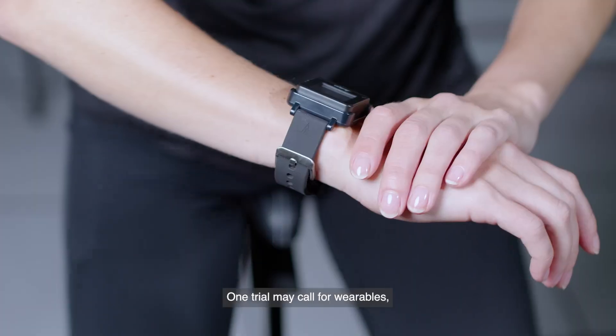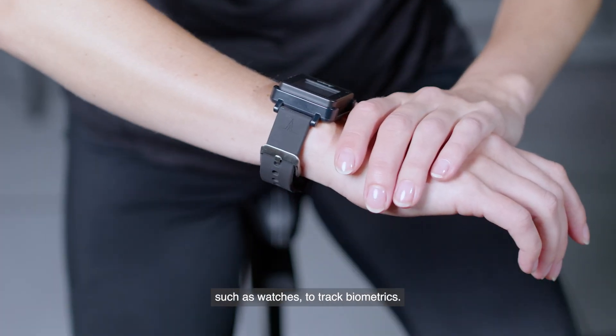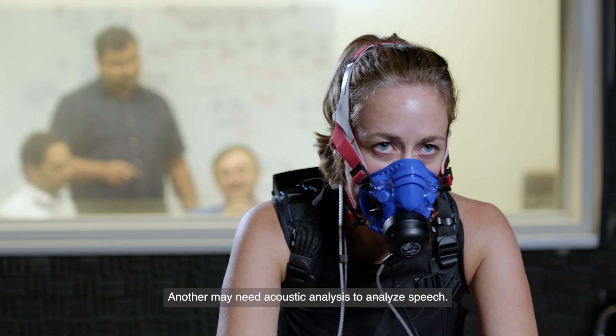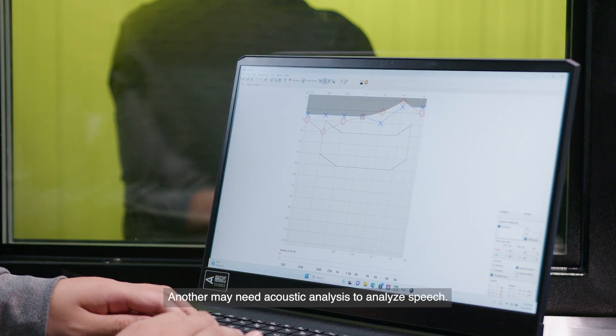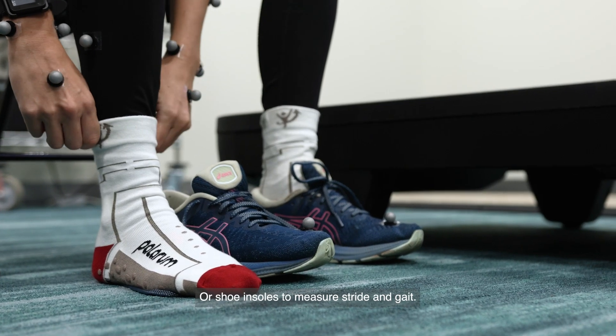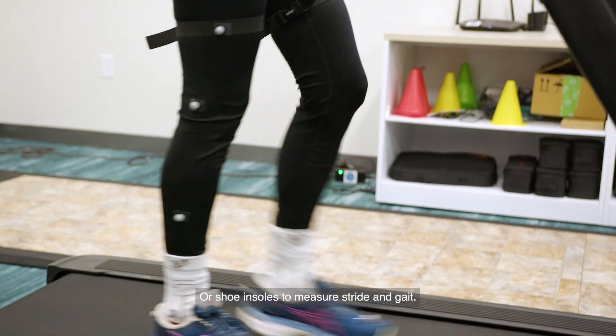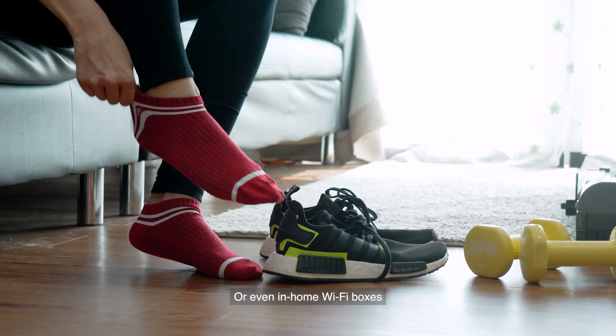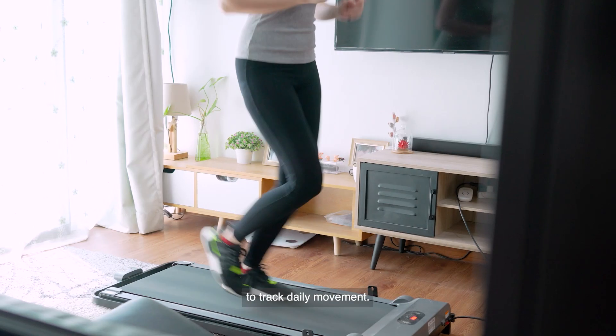One trial may call for wearables such as watches to track biometrics. Another may need acoustic analysis to analyze speech, or shoe insoles to measure stride and gait, or even in-home Wi-Fi boxes to track daily movement.